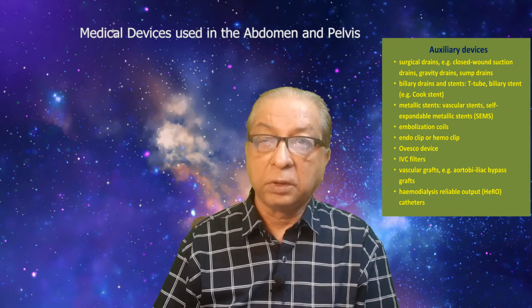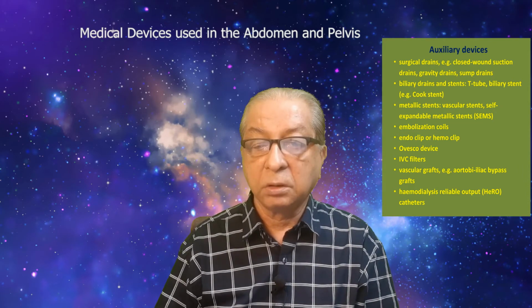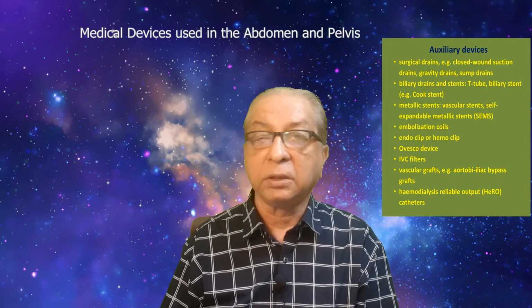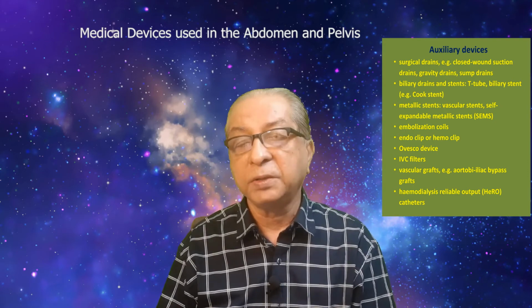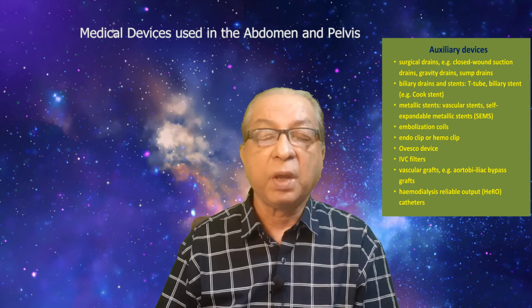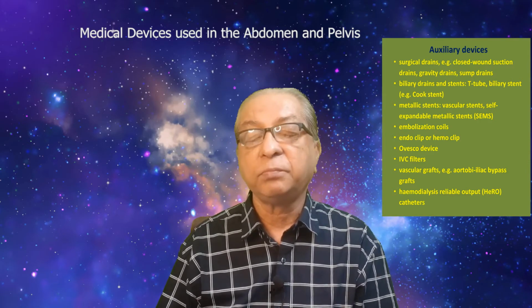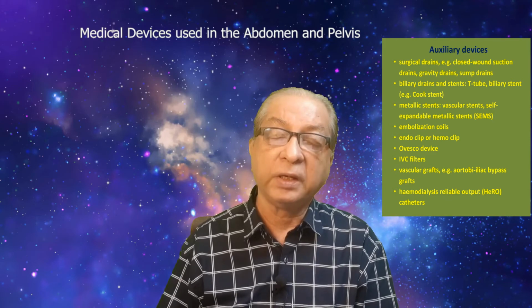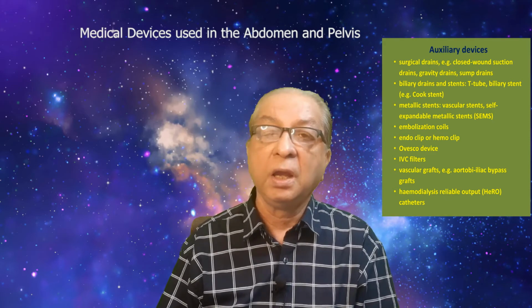One very common feature is that many of the genitourinary devices may migrate. The doctor may put it in one place, but the device may migrate from that place to another. When it migrates from the intended place, it becomes a hazard.